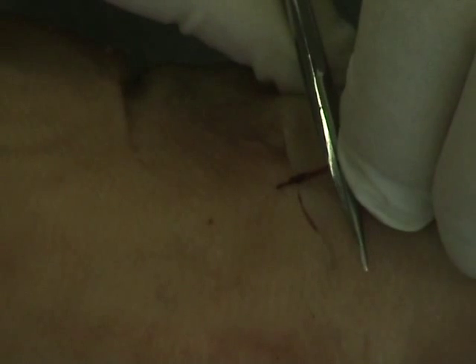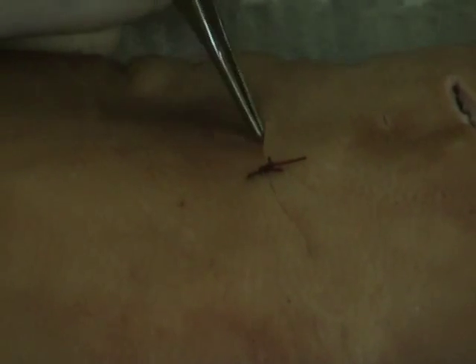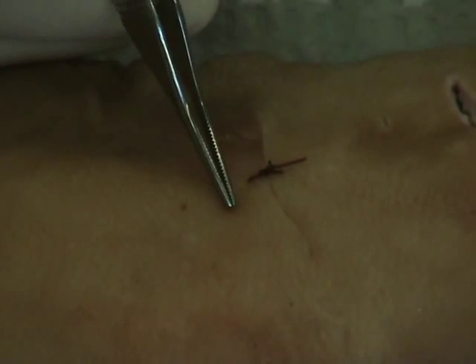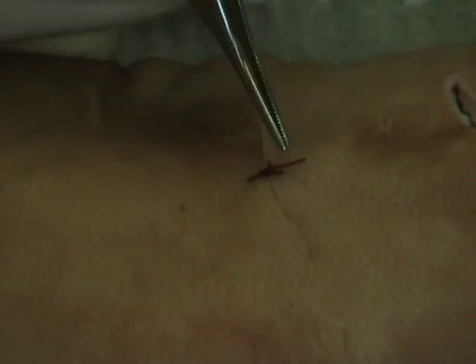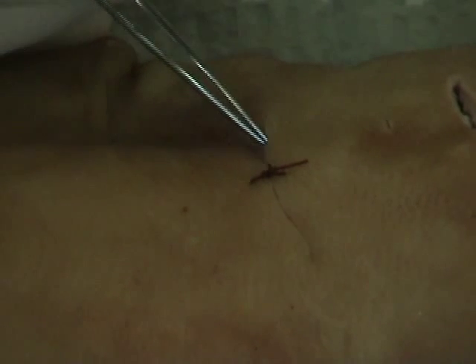Now, when I make my actual curve on one side, you notice I didn't make a half of a circle. I'm making kind of like half of an ellipse. So that when I go ahead and close this up again, this should close up very nicely. You can see it's going to close up very nicely. If I make a big position like this, I'm going to end up with dog ears, significant dog ears in this regard. So what I do is I basically consider this as 1/2 of a 3:1 length to width ratio ellipse, and I close up. So I'd go ahead and put simple interrupteds, 2 simple interrupteds probably on each side to finish closing this up. And this is the curving of the ellipse.